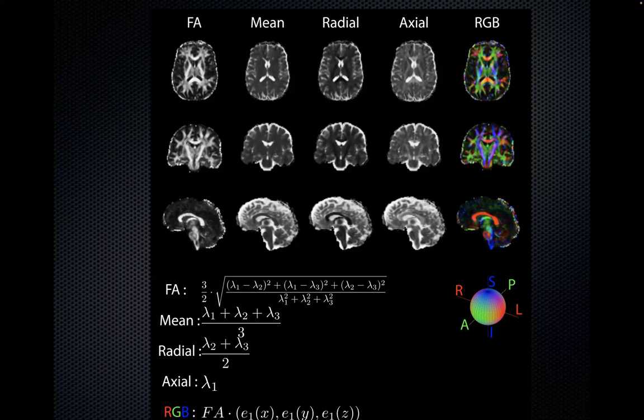But yeah, DTI is here to stay, no matter what we improve. And I don't know if you realize I would change my message, but I used to be against DTI. DTI is wrong. We need to model this and be better than DTI. DTI is bad. No, DTI is great. It's super useful. And doctors barely use this now. So before we go to the next step, let's understand what works well here. And when it doesn't work well, let's provide better tools to interpret what's going on.